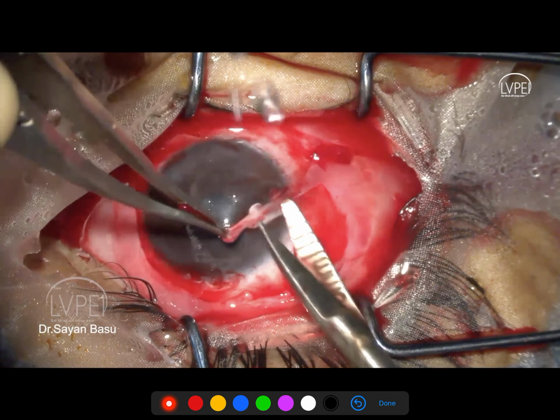Again, here I'm doing a little bit of cleaning up with the cautery, making sure that there are no bleeders by the time I reach transplantation, and this is always a wet cautery, remember that. Now I'm going to put the amniotic membrane down. Always remember that the amniotic membrane is always put basement membrane up, or stromal or sticky side down. There is no other way of putting the amniotic membrane, and there is no need to put two membranes. One membrane is enough. So I'll fold the membrane, make sure that it is distributed properly, that there is enough on all sides. So make sure that it is well centered.